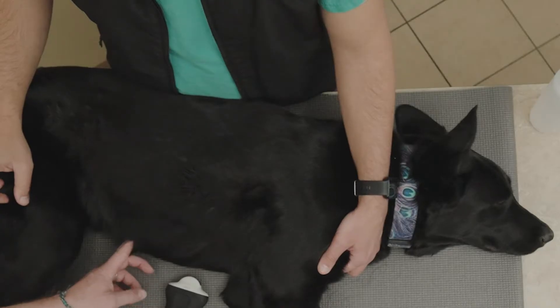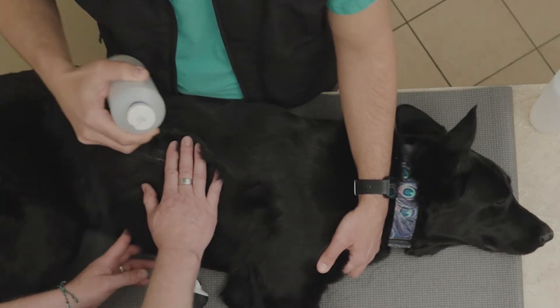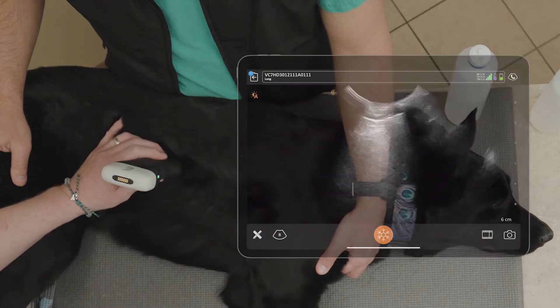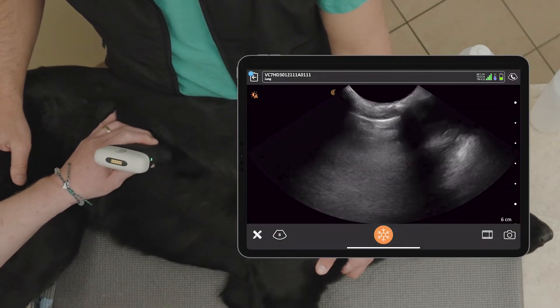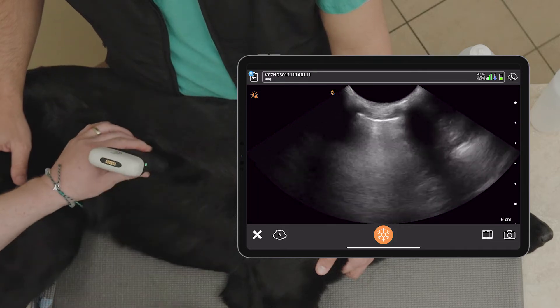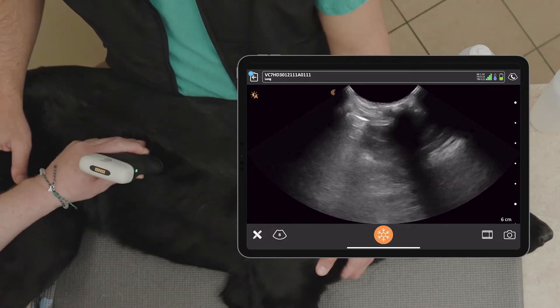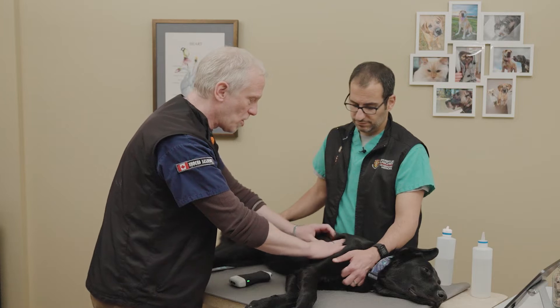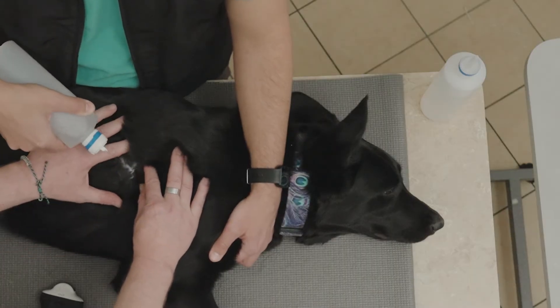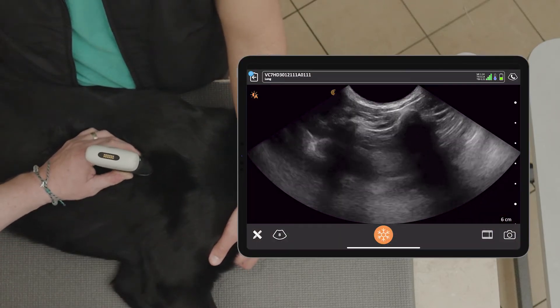For example, if I palpate the subsiphoid and come straight dorsal, I separate the fur and look to see where I'm at. I can see that coming straight dorsal from the subsiphoid, I'm actually sitting partly over the abdomen already — the last rib is way back. That's why we say to use your borders rather than guess. So we start just caudal to the front limb, separate the fur, pull the skin forward, then place the probe perpendicular to the ribs with the marker towards the head. When we do that, we get the classic bat sign.